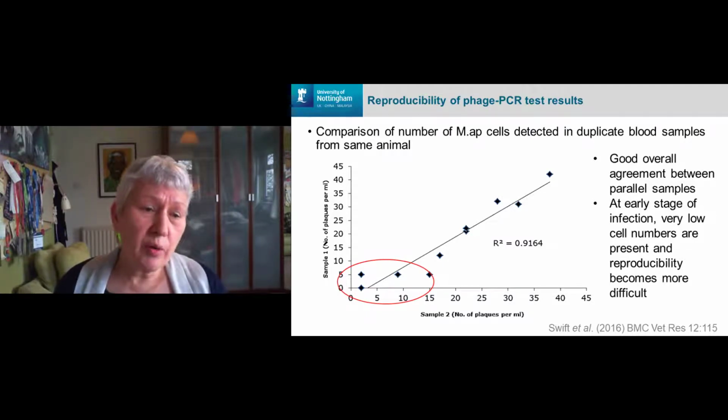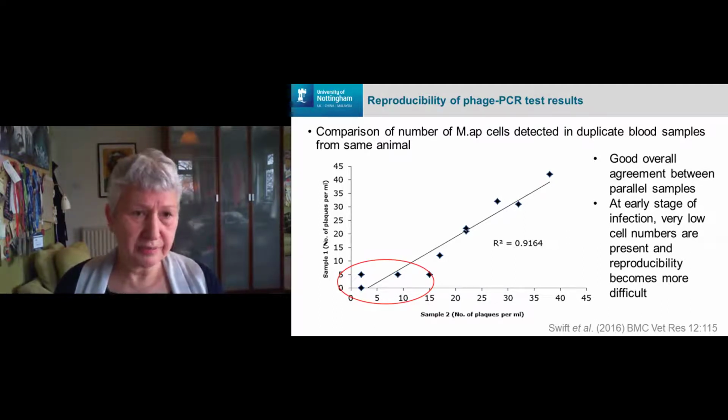And so we're not worried about this sort of bouncing around here, but that is often what we would expect to see with these very low numbers of samples. We would expect to see some fluctuation in our results.